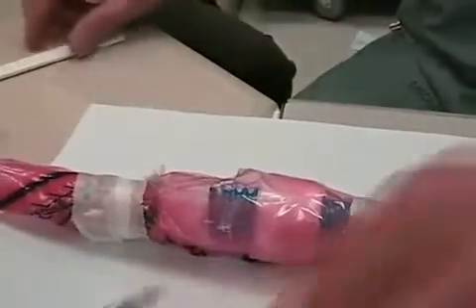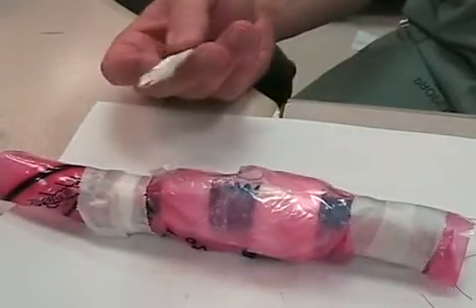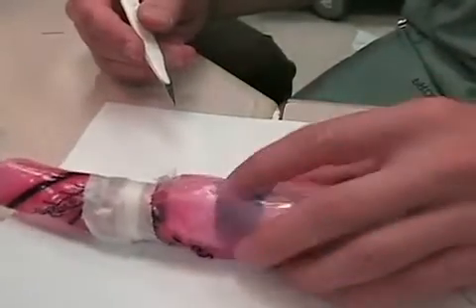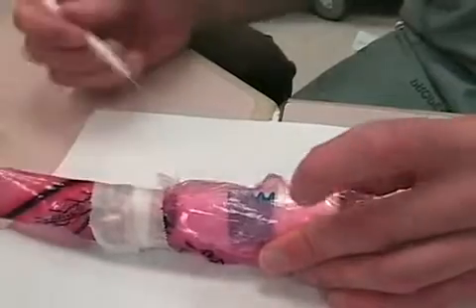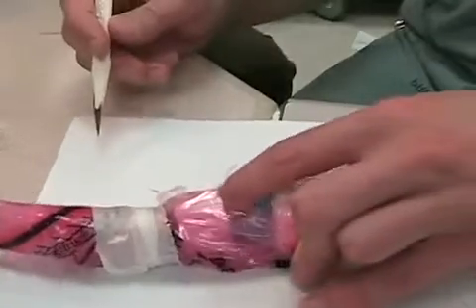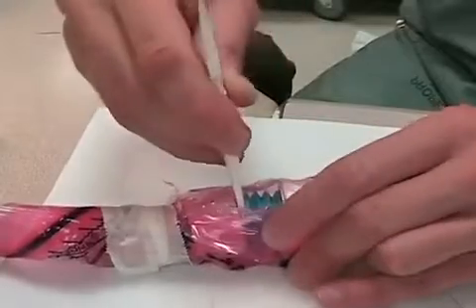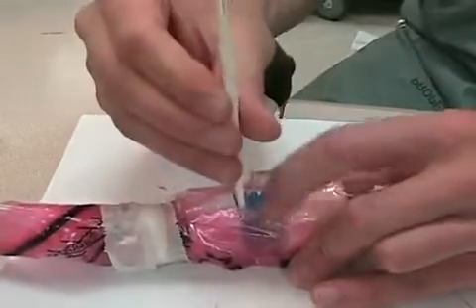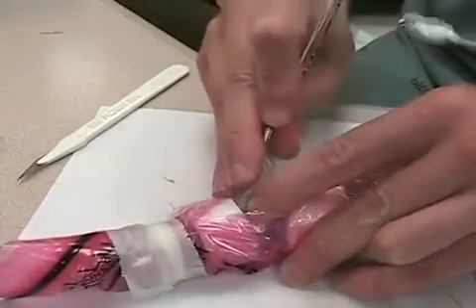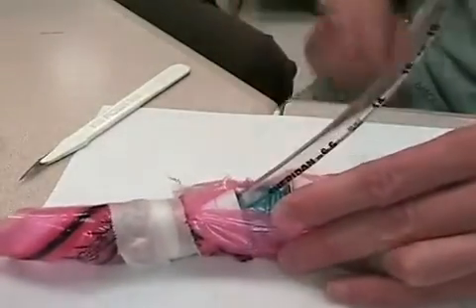Last thing: what do you do if you have no equipment? This is a crash crike. You still need a scalpel — hopefully an 11 blade but whatever you have. Find the membrane with your finger, make a nice big skin incision, find the membrane again, horizontal incision through the membrane, get your finger in there. Take the back of the scalpel handle and get it in the hole, take your finger out, turn the scalpel handle to widen the hole, get your finger back in, take your tube, insert horizontally, orient vertically, and jam it in.